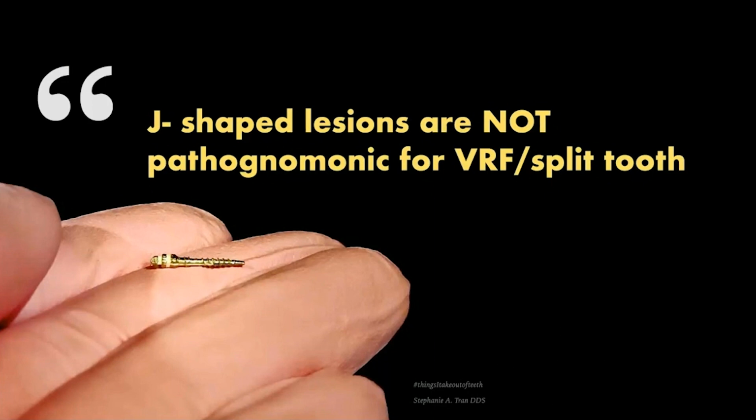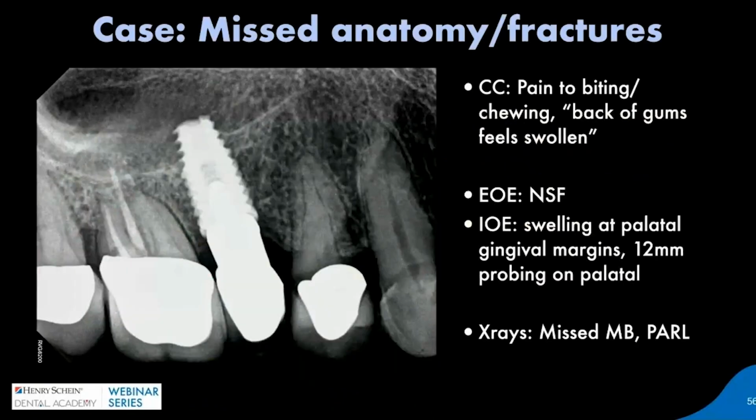What does that mean? It means that a radiolucency that appears to be kind of off-centered or coming up the side of the tooth does not automatically mean that the tooth is cracked. This is definitely a misunderstanding. So how do we read them instead?